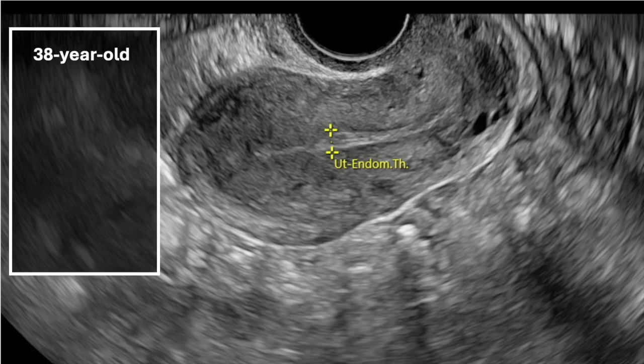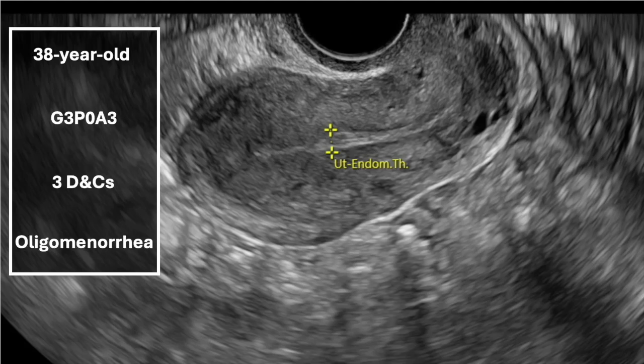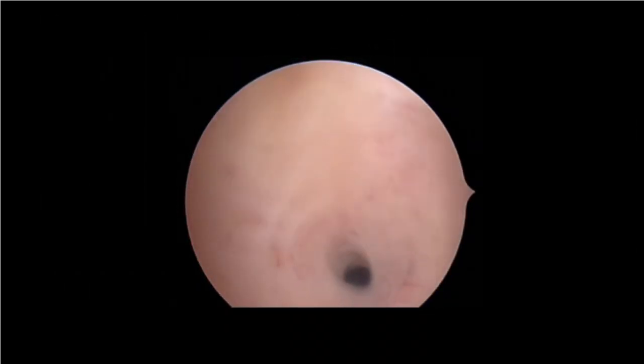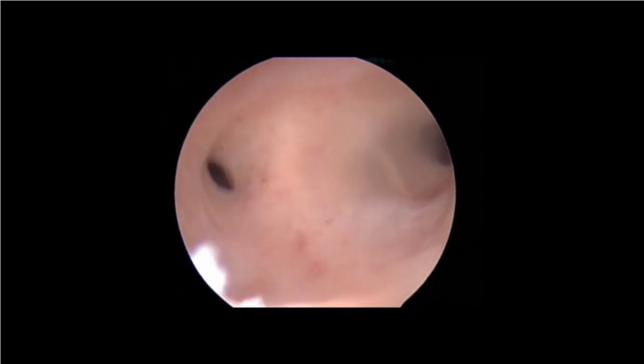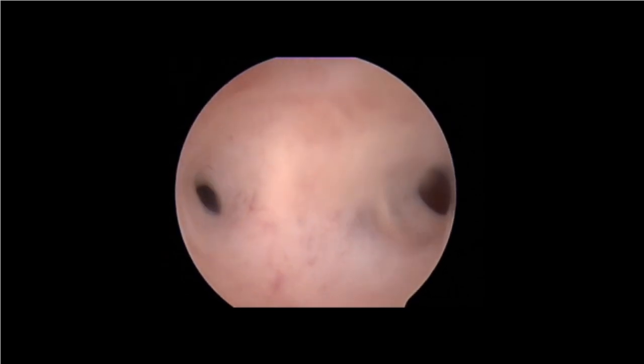We present the case of a 38-year-old woman with a history of three first-trimester pregnancy losses, all treated with dilation and curettage. She desired future fertility. During the ultrasound examination, it was noted that the endometrial lining was interrupted and did not reach the uterine fundus. The hysteroscopic examination revealed dense uterine adhesions occupying the uterine cavity, preventing the visualization of the tubal ostium.